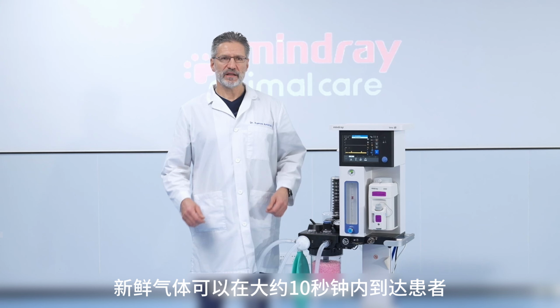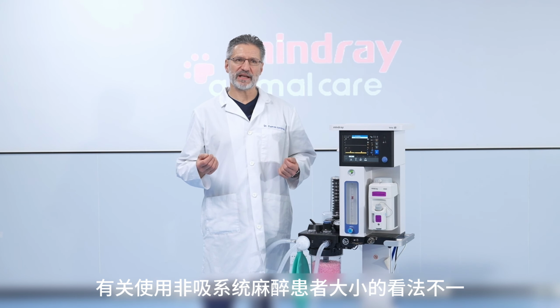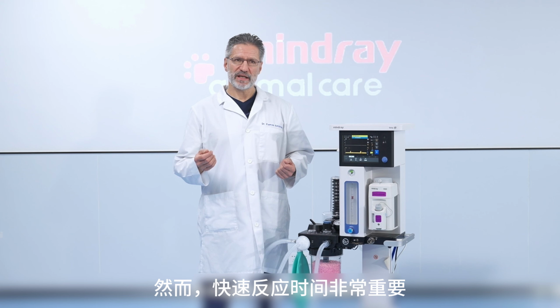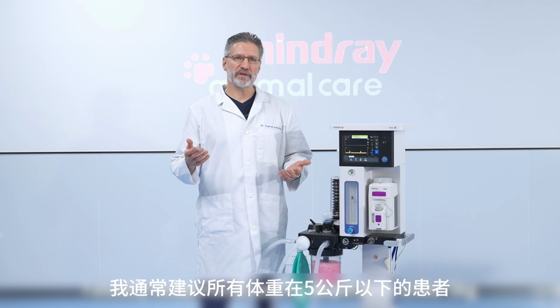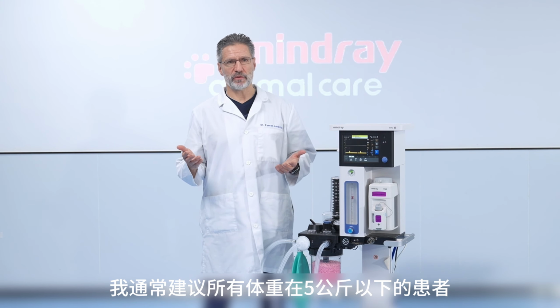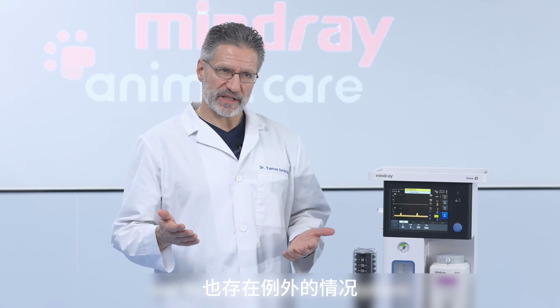The response time of a non-rebreathing system is way faster, and the new fresh gas can reach the patient in about 10 seconds. There are different opinions regarding the size of a patient that should be anesthetized on non-rebreathing systems. However, because rapid response time is especially important for veterinarians performing a large number of short procedures such as spays and neuters, I usually recommend putting all patients under 5 kg onto a non-rebreathing system. This guide is not written in stone, and there is room for exceptions.